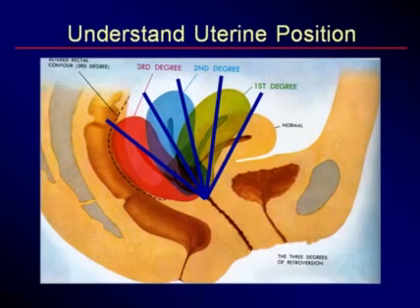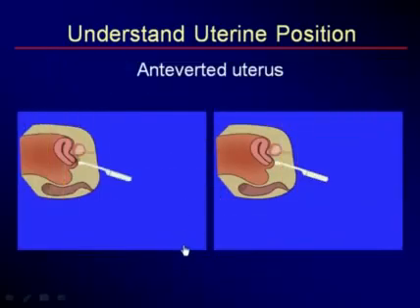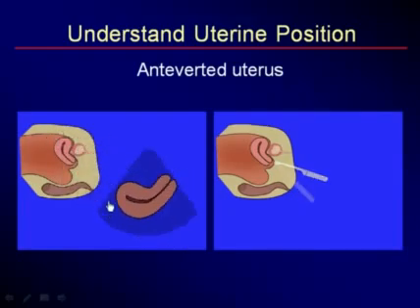The uterus can be anteverted, usually. It could be in the mid portion of the pelvis, or it could be retroverted. And we have to understand the position so we can place masses correctly, place fibroids correctly in such a plane. So here's the standard view. This is sagittal. This is anterior. So this is the anterior wall, rotated 90 degrees.